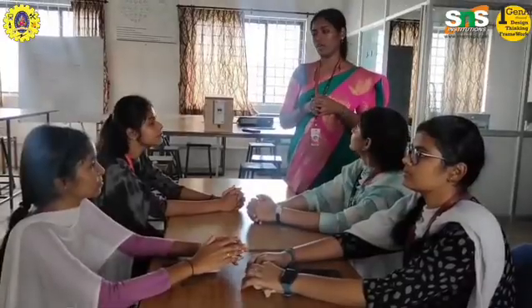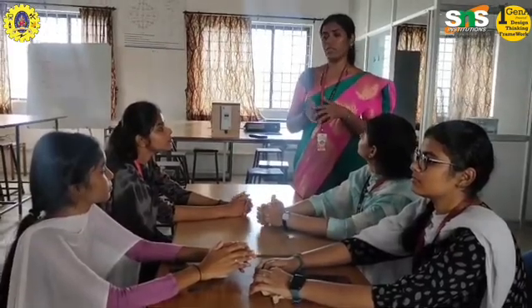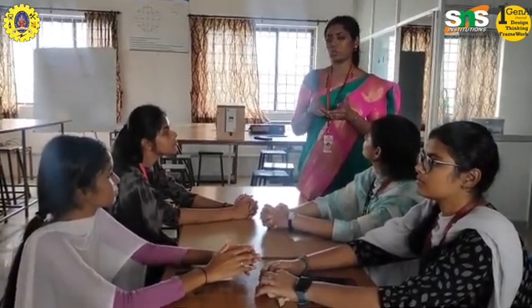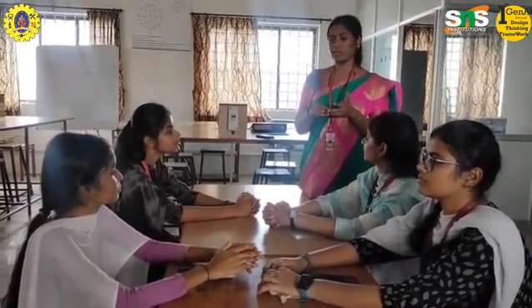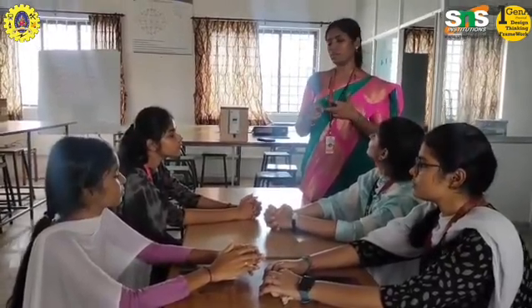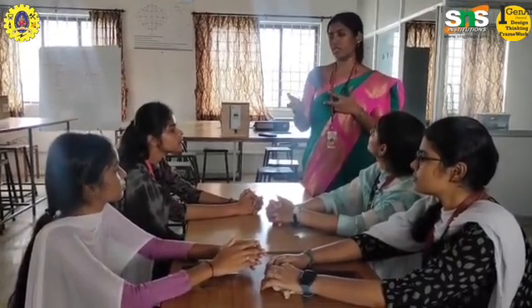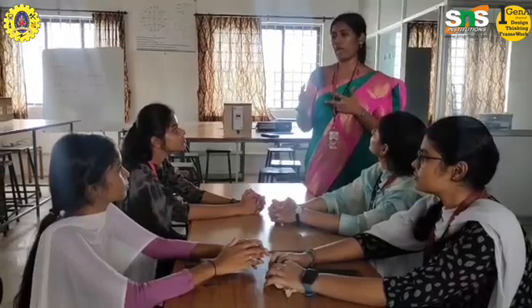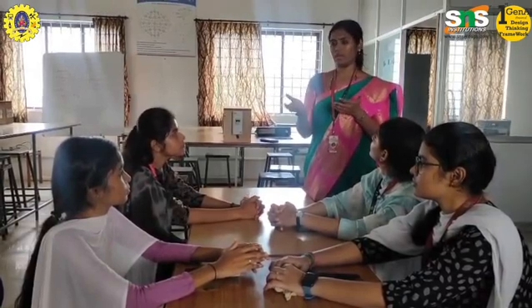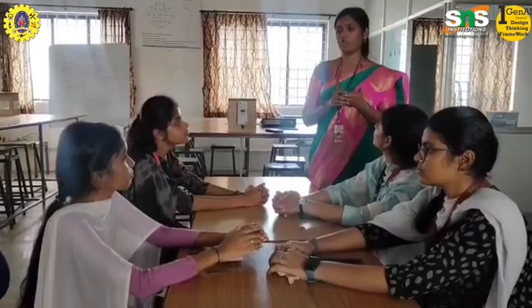So what Kavya is asking, in the sense, is how about tissue damage in the case of ultrasonic diathermy? Because in other conventional techniques like shortwave diathermy and microwave diathermy, we also have the same heating principle. There also we are sending waveforms. But the main advantage of ultrasonic diathermy is that we have deep penetration compared to the others. So here comes the question, how about tissue damage when we have a long penetration? That is the question Kavya is raising. Does anybody have a counterpoint for this?